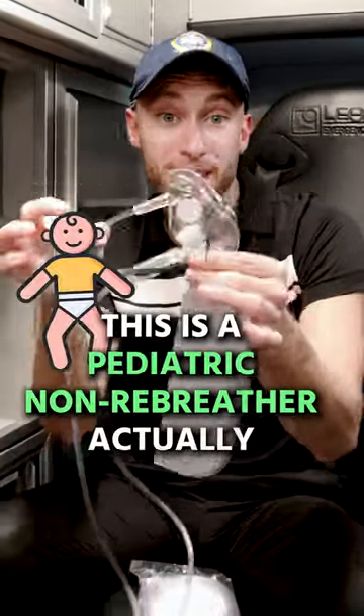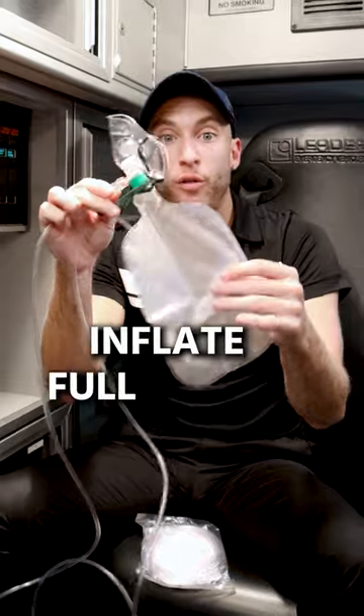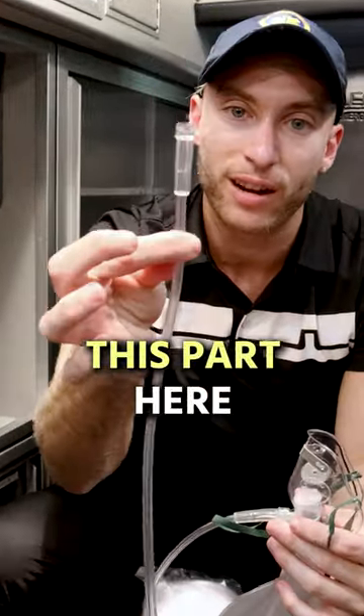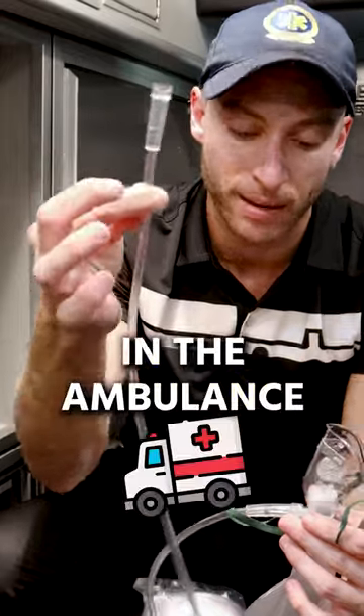This is a non-rebreather — a pediatric non-rebreather, actually. We want to see this bag inflate full of air. This part here is actually going to connect into the oxygen port in the ambulance.